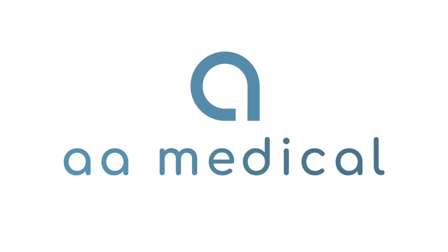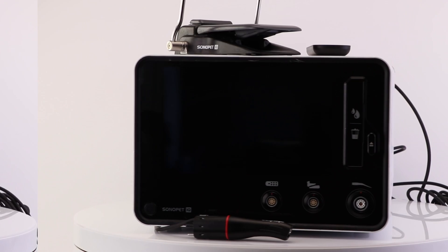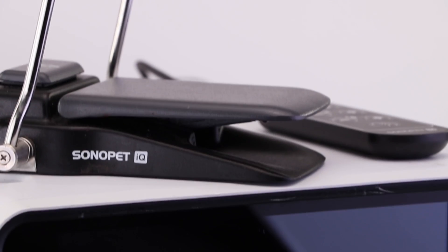Hello and welcome to a medical product feature on the Stryker Sonopet IQ ultrasonic kit. The Stryker Sonopet IQ is an ultrasonic aspirator system for soft tissue resection and fine bone dissection.